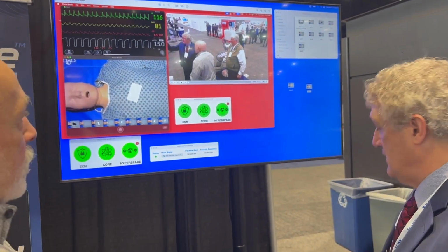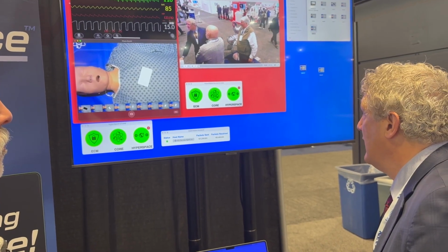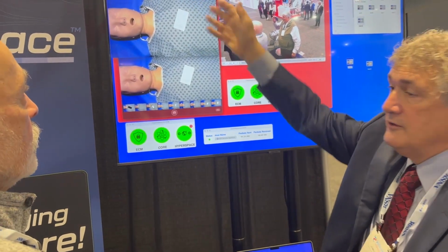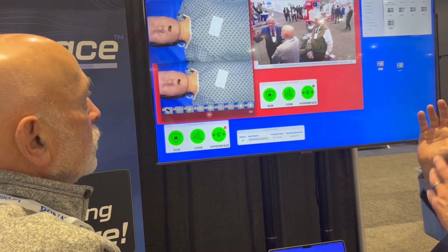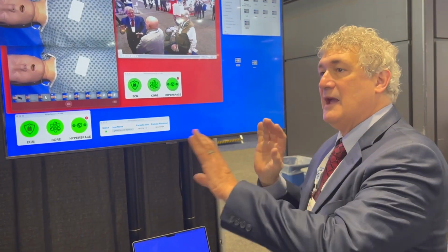And if I take that picture I just took, and I bring it to my local desktop, I want to have more close analysis of it. I can bring that picture up, and you can see that this is the picture that was over there, and you can do your analysis. So you have access to the remote system, and it's a secure access and a high performance access.